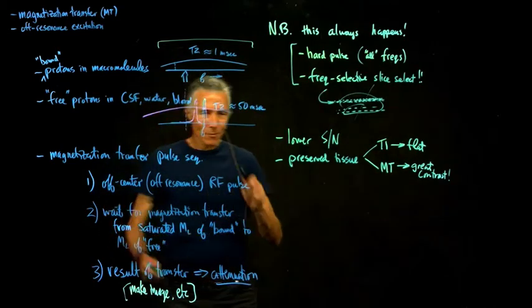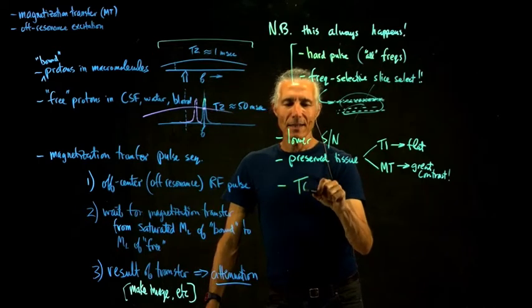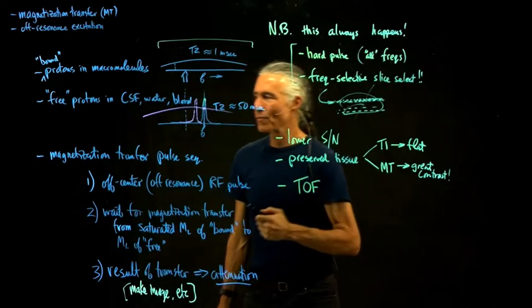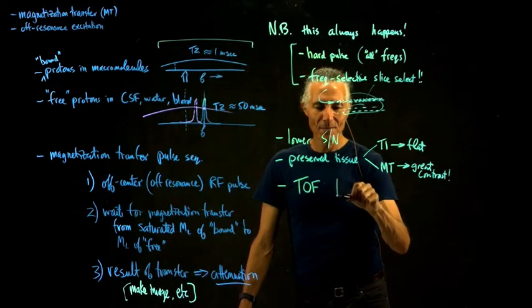Okay, and there's one last thing that magnetization transfer is commonly used for, that you'll see on the scanner, and this is called a time of flight scan.